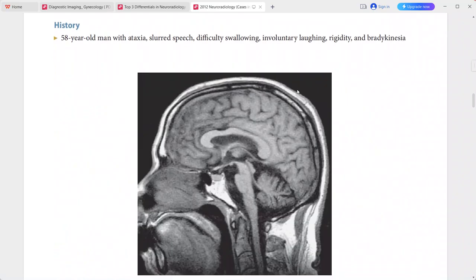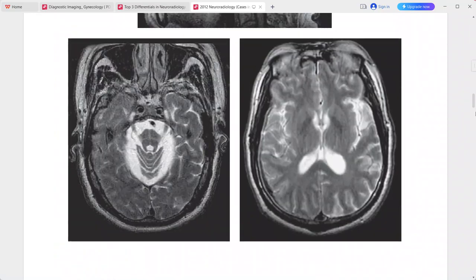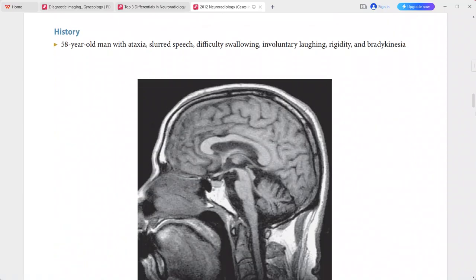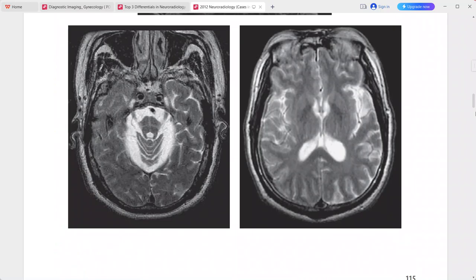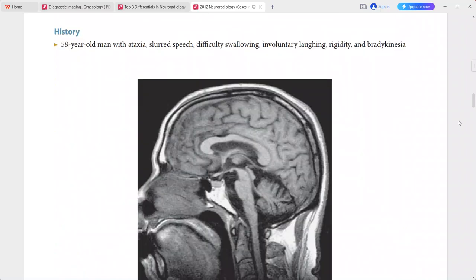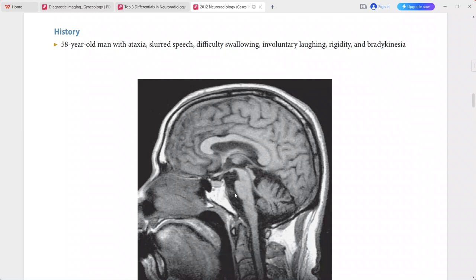Next: a 58-year-old man presenting with ataxia, slurred speech, difficulty swallowing, involuntary laughing, rigidity, and bradykinesia. Sagittal T1-weighted MRI shows marked atrophy of the pons and cerebellum.